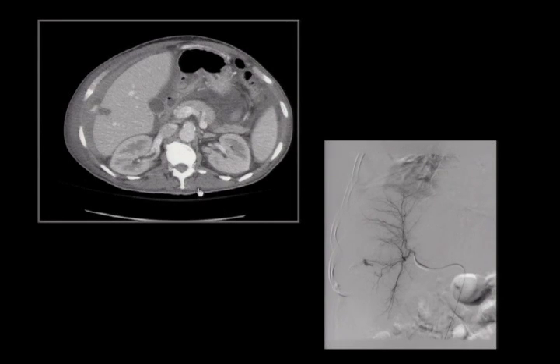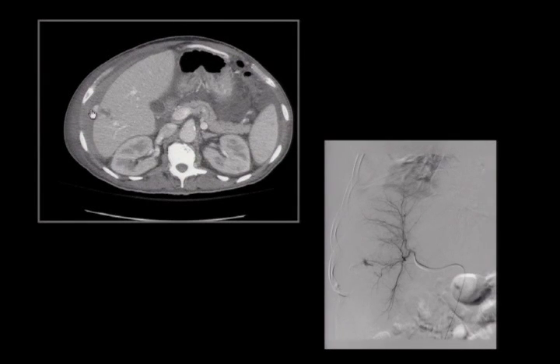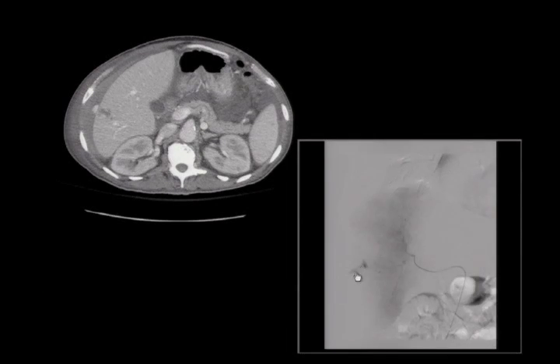Here is a patient who suffered a major complication after percutaneous biopsy: a large hematoma with blood tracking around the liver and gallbladder. The patient was immediately taken for contrast-enhanced CT, where we can see a lot of blood around the liver and throughout the abdominal cavity, and around the spleen. In the area of biopsy there's a defect in the liver, and adjacent to that a little bright signal representing iodine in arterial blood actively leaking—we're visualizing the patient bleeding on the CT table. An urgent intervention was demanded: a catheter was placed into the groin and into the liver to deliver embolic agents to stop the hemorrhage.